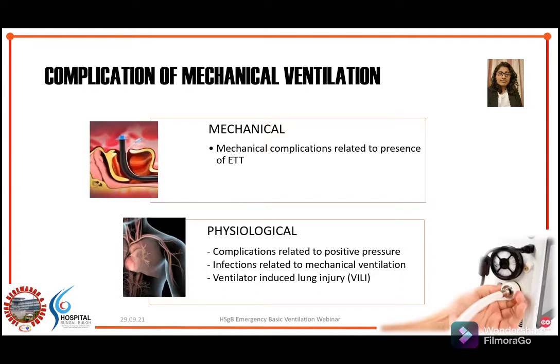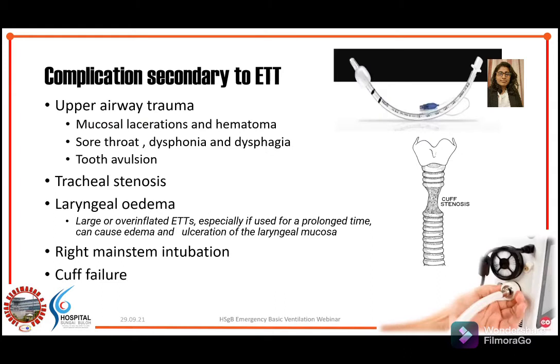So mechanical is the mechanical complications related to the presence of the ETT itself in the airway, and physiological is the complications related to positive pressure ventilation, infections that come about after a patient is mechanically ventilated, and ventilator-induced lung injury. So going to mechanical complication of intubation.